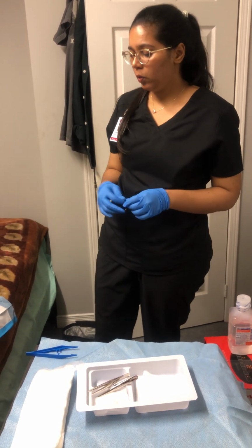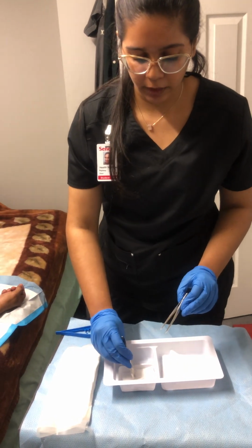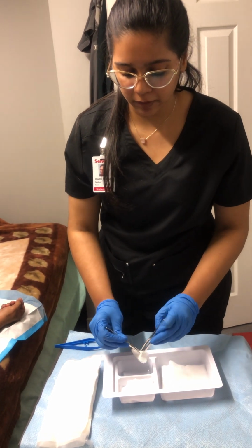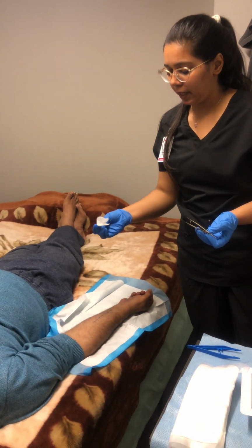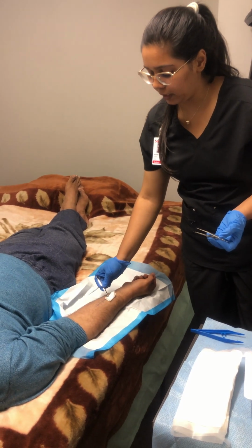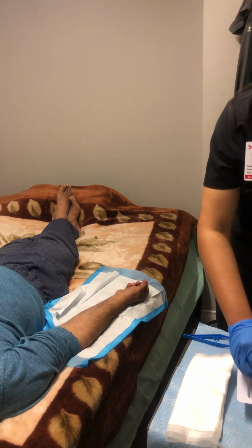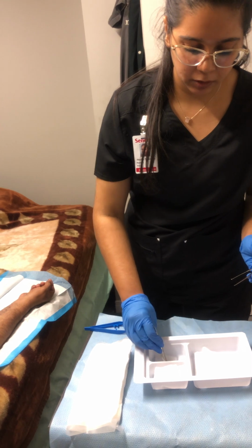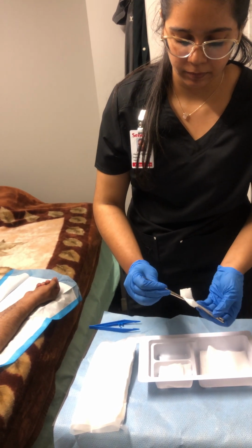And now we are going to clean the wound. So we will pick up a swab, dip it into the saline solution, and squeeze it, and then from the midline, from head end to toe end, from least contaminated to most contaminated area, we are going to clean it. And we will discard it in the garbage bin. We will take another swab. We will dip it into the solution. We will squeeze it.